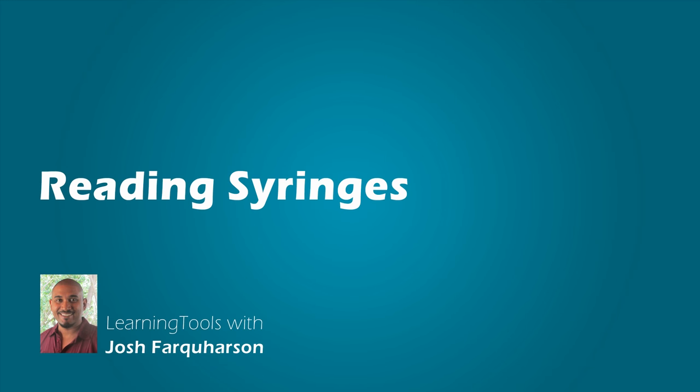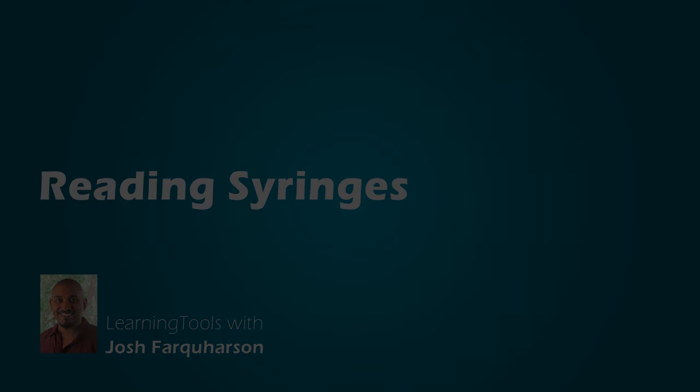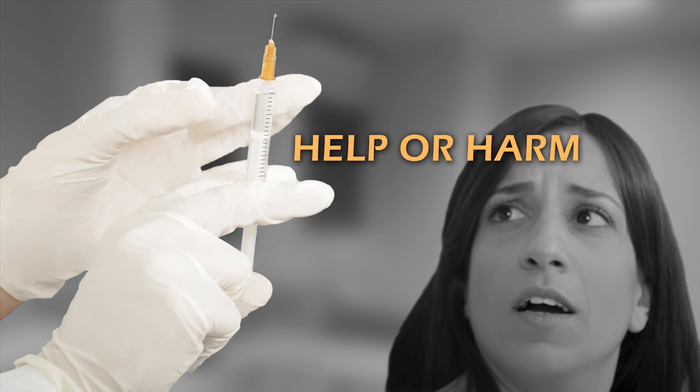Hi, I'm Josh Farkason, and welcome to Reading Syringes. Learning how to read a syringe could be the difference between giving patients the correct dose of medication and helping them, or giving patients the wrong doses of medication and harming them.